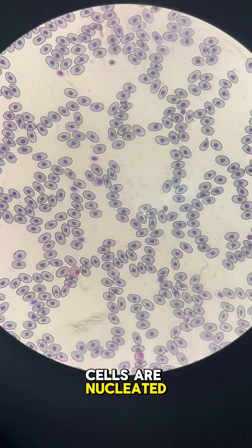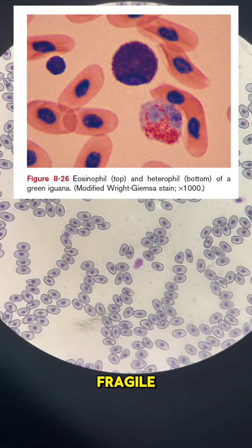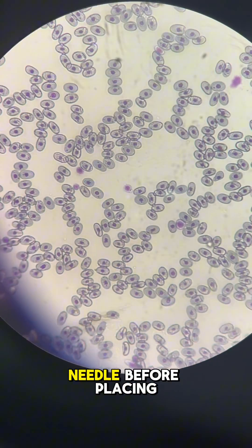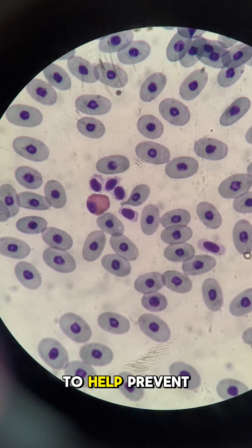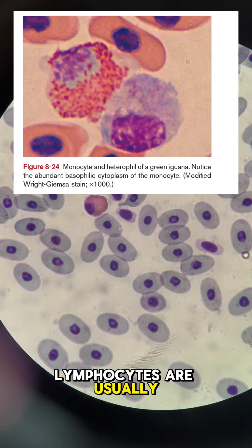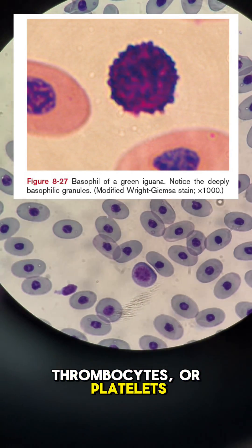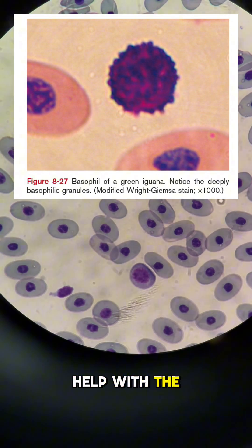Their red blood cells are nucleated and are rather large when compared to other vertebrates. They're also quite fragile, so many vets recommend removing the needle before placing blood into the tubes to help prevent lysis. As for the white blood cells, lymphocytes are usually the most common, but this can vary by species. Thrombocytes, or platelets, are also present, and these help with the clotting of the blood.